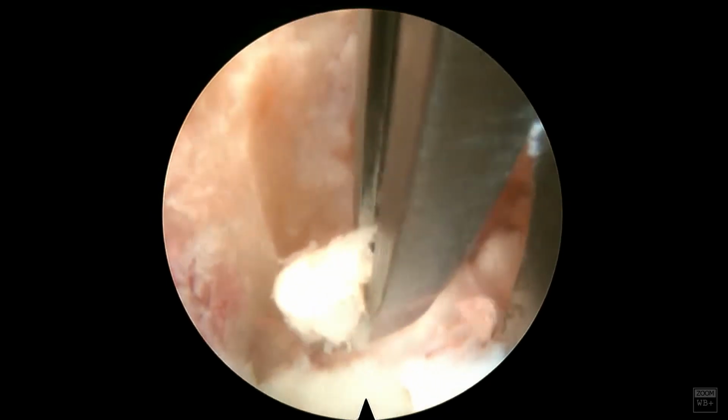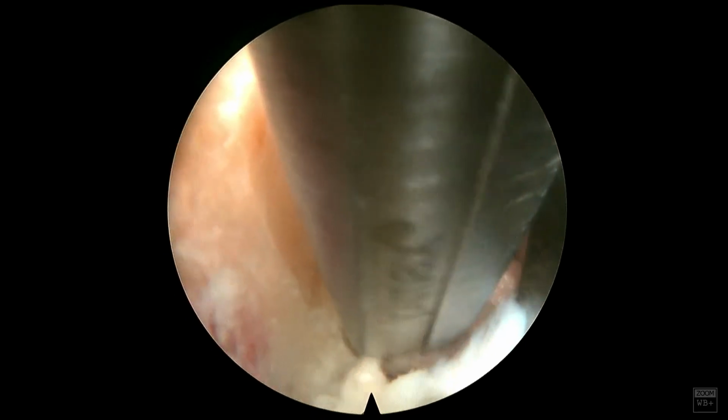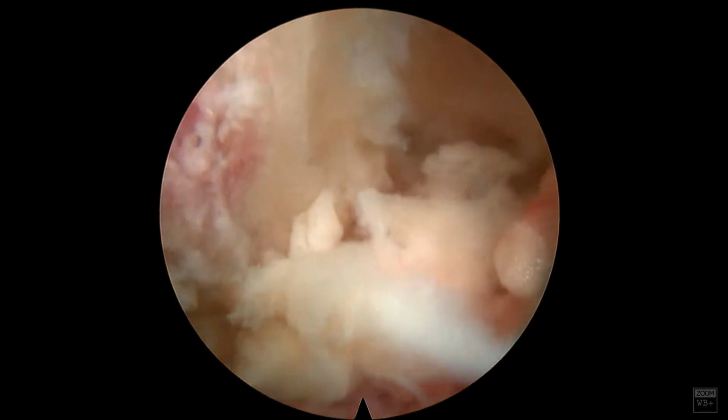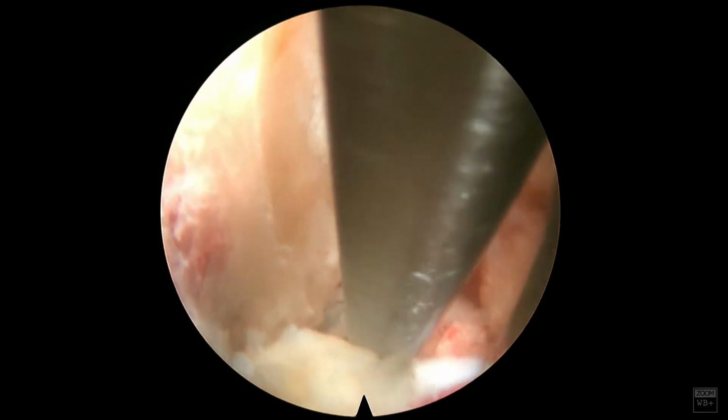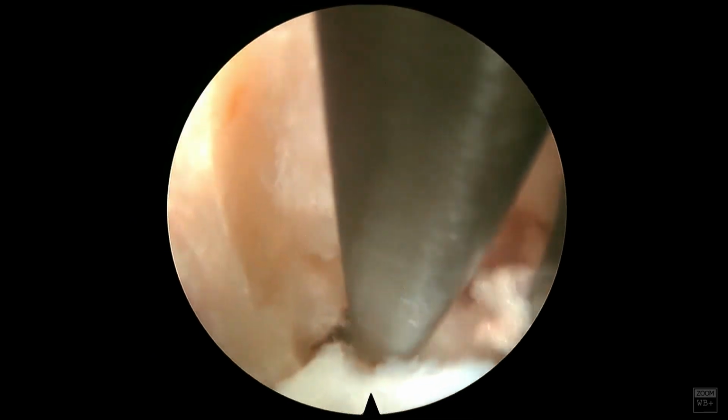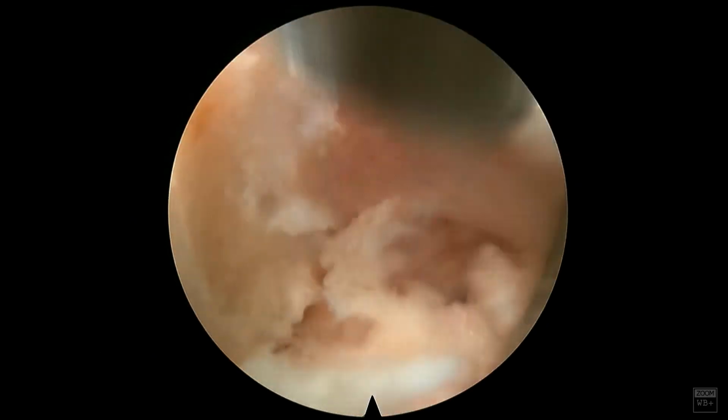Again, in a lot of these foraminal stenosis cases, the tip of the SAP as well as the ligamentum flavum is what impinges on the nerve root, as well as the disc bulge anteriorly. In this case, we'll talk about the disc herniation towards the end of the case.